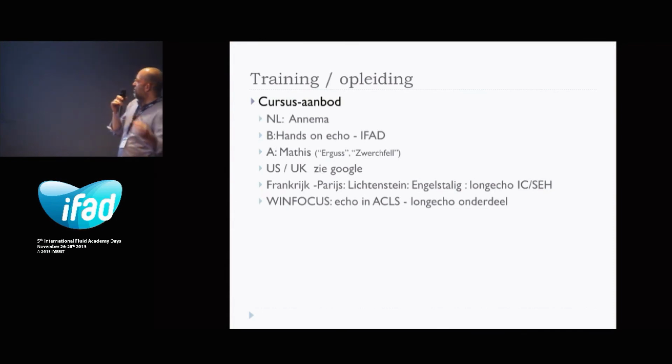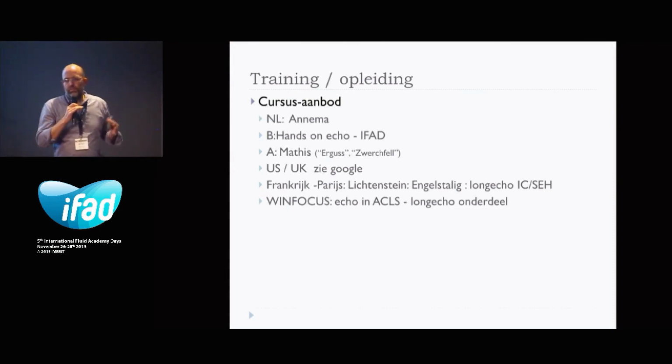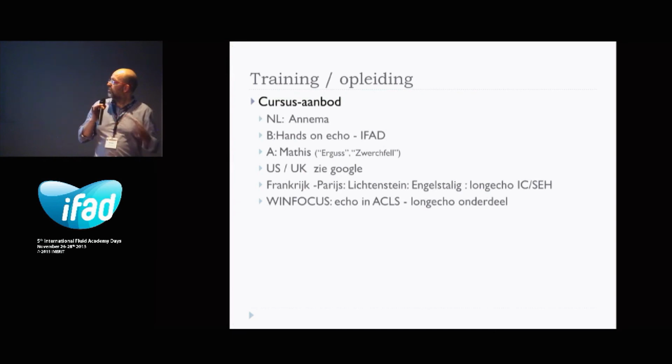Okay, this is some examples of what I did last year with ultrasound in the emergency and on the intensive care. So I hope I can make you a little bit enthusiastic to learn this. You have a lot of courses. Of course, we had a hands-on now and IFAD. You can go to France.